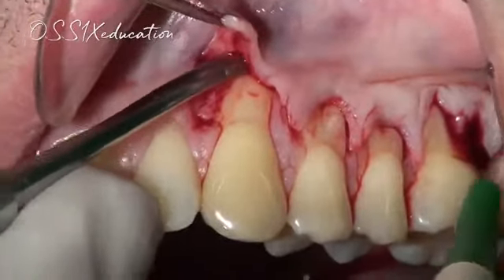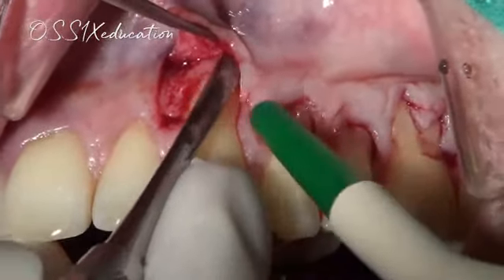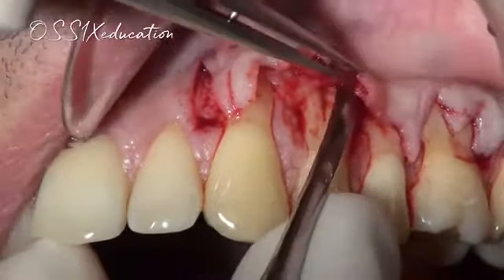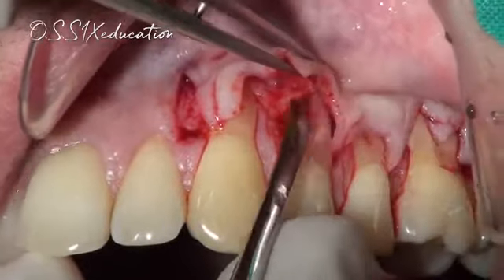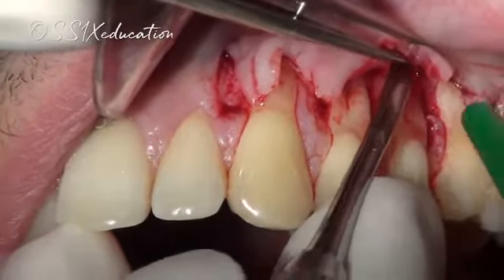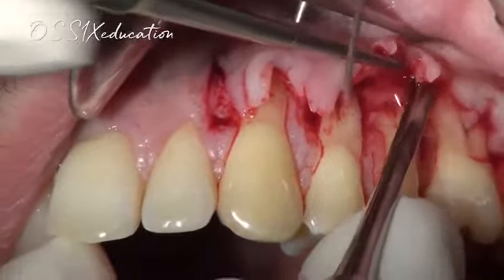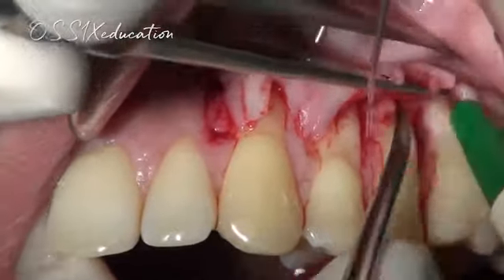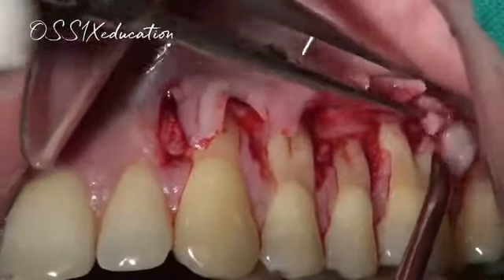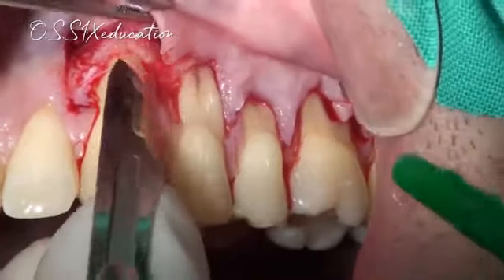We just go a little bit more apical to the bone, like that, not too much. There it is. That's sufficient. That's enough. You don't need a lot of it. It's a little bit more difficult in the molar area, especially when you're filming. So you're looking from it. And now we're cutting the periosteum.